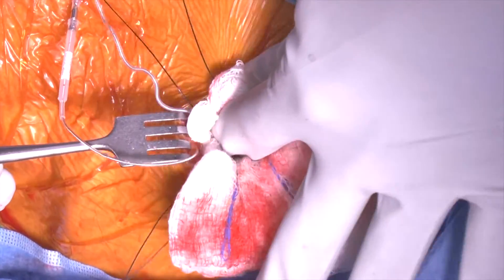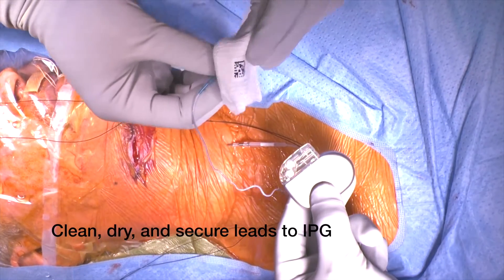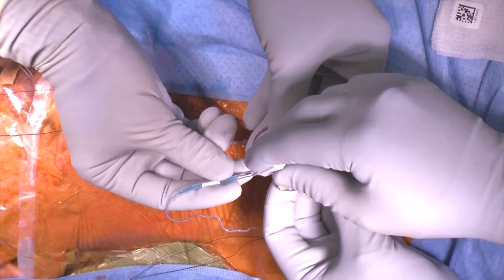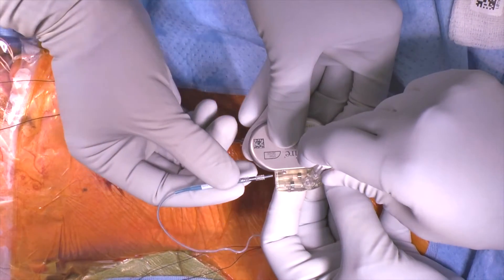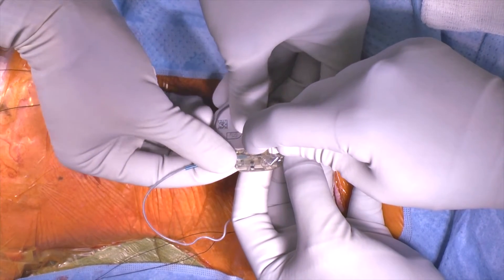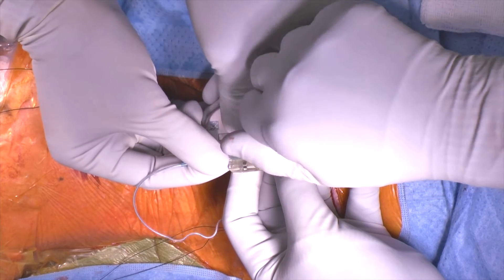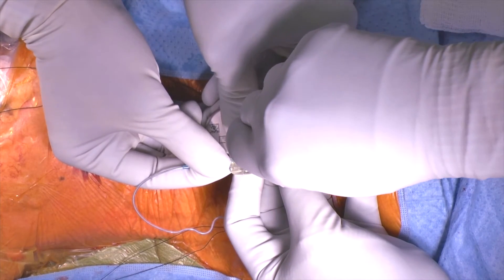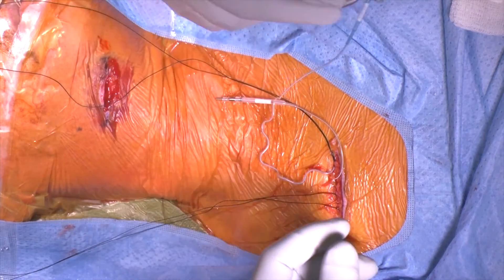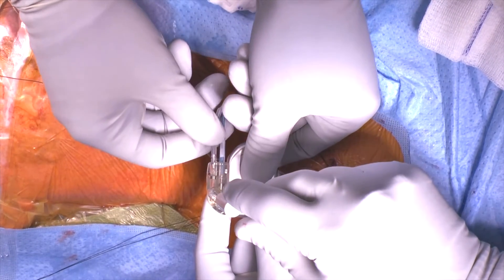There are two securing stitches for the implant pulse generator placed superiorly in the wound — both are 2-0 silk sutures secured to the pectoralis major fascia. Next we're going to insert the leads into the implant pulse generator. Drying off the posts is important. We place the wrench into the diaphragm on the implant pulse generator to release any air, and then insert the lead until it can no longer be inserted, followed by ratcheting down the screw to secure the lead in place. Once it's affixed, we do a small tug to make sure there's no wiggle room and also ensure that the lead is in full contact with the post. The stimulation lead is then inserted in a similar manner.